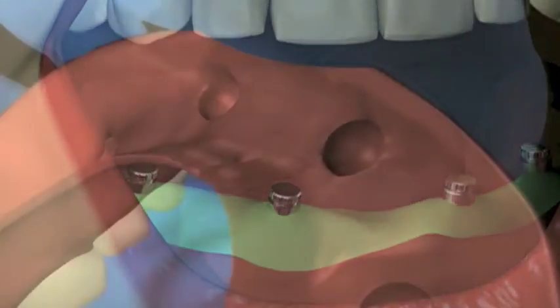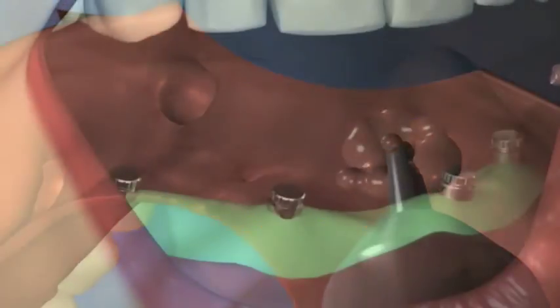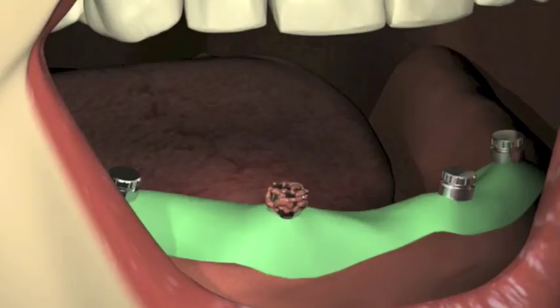Clean, wash, and dry the denture. Fill the abutment recesses with self-cure resin. Paint a small amount of this material over each retentive housing.